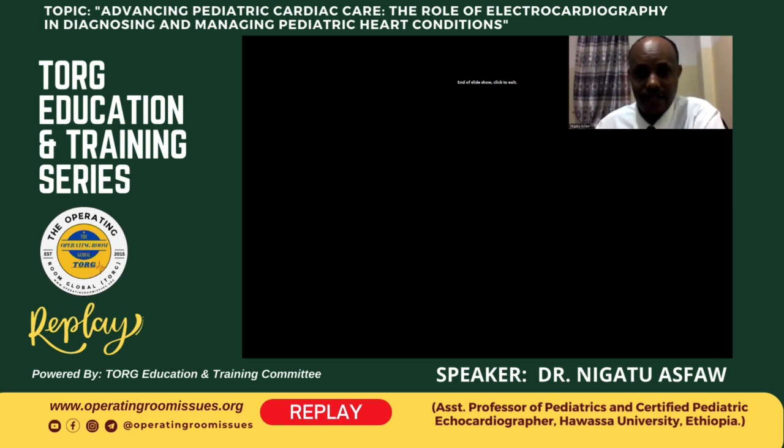So if there is an ECG abnormality, that may result from an organic cardiac problem or other systemic problems which can result in these rhythm abnormalities or the change in amplitude of the waves. So we need to further evaluate the patient, particularly using echocardiography. So that can help us particularly in screening.